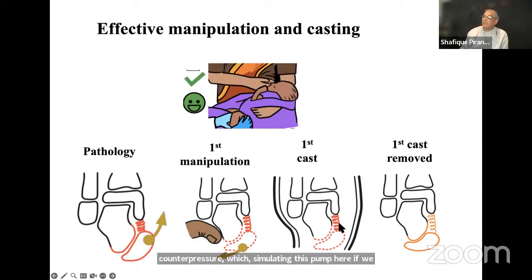So I think that below knee casts, if you have a way to stop the leg from rotating, might be possible. But generally speaking, I don't know anybody who has actually discovered a technique of making it happen that way.